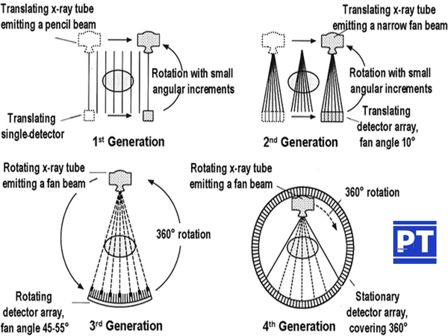It is otherwise known as conventional CT since it has a cable connection. So continuous rotation of the tube-detector system is not possible in a third generation CT. Moving on to the fourth generation, you can see an array of detectors with the X-ray tube inside the detector ring. The X-ray tube is rotating, so it is known as rotate-stationary.